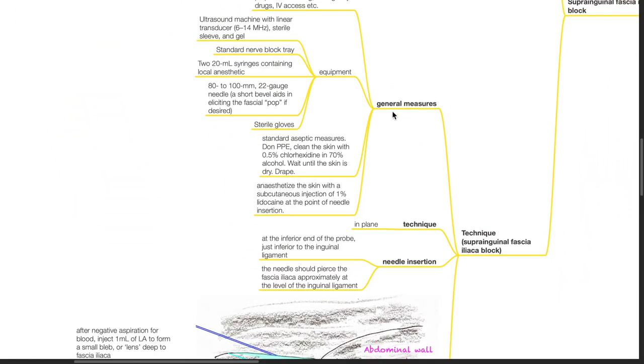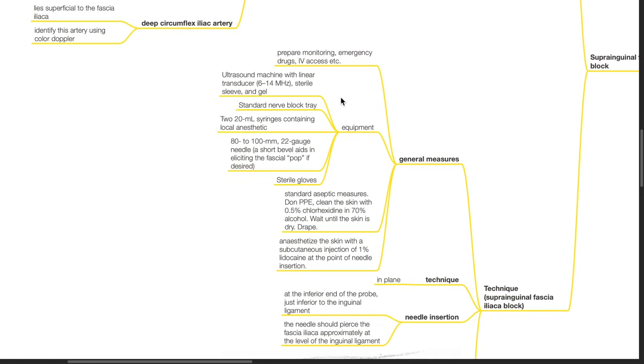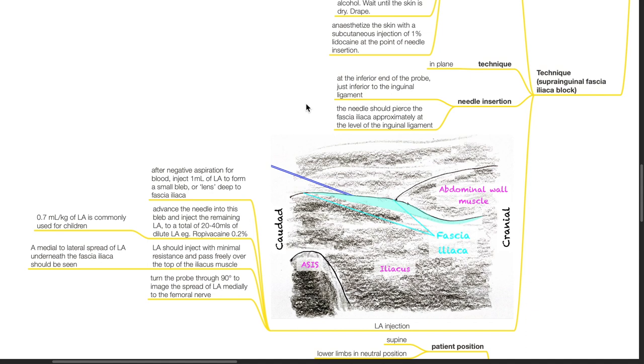Technique. General measures. Prepare monitoring, emergency drugs, IV access and equipment. Use standard aseptic measures and anesthetize the skin with 1% lidocaine. In-plane approach is recommended. Needle insertion should be at the inferior end of the probe, just inferior to the inguinal ligament. The needle should pierce the fascia iliaca approximately at the level of the inguinal ligament.